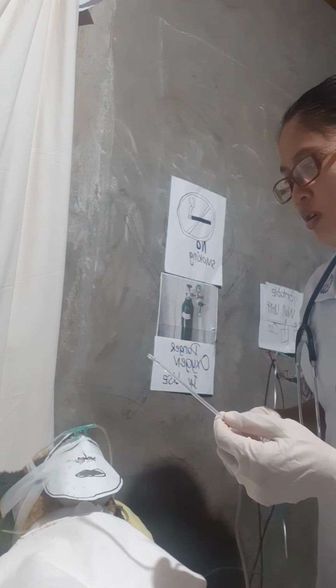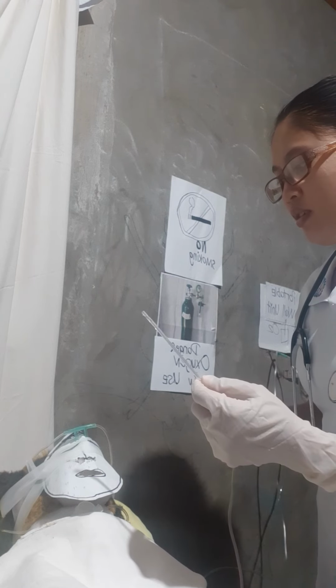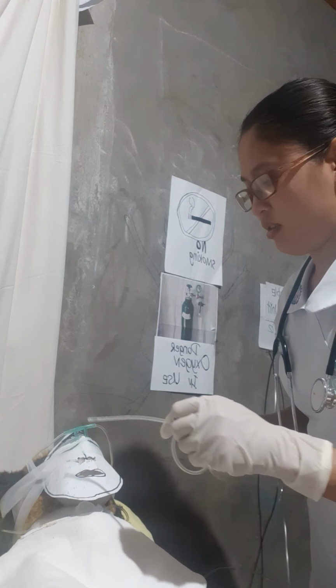For nasopharyngeal suctioning, we need to insert the sterile catheter gently.